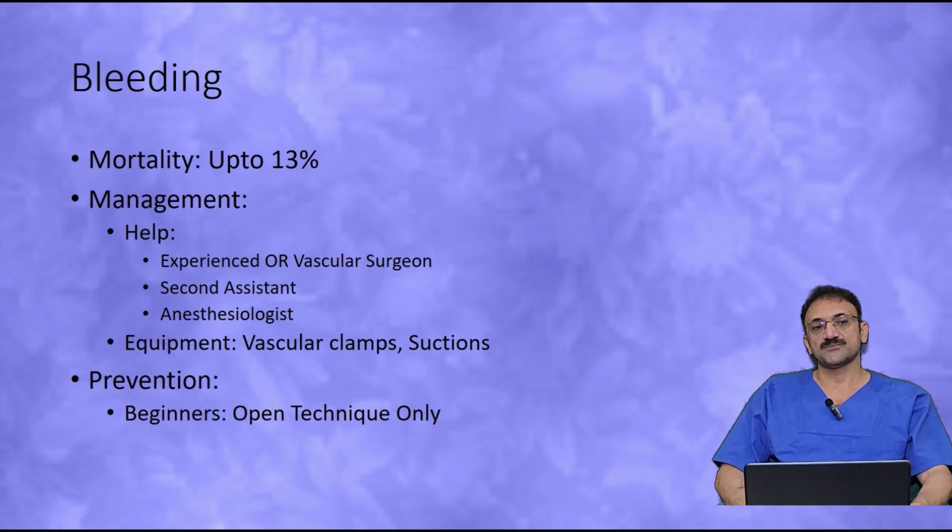This first trocar can be a 5 millimeter. For example, in a right-sided nephrectomy, you place it in the right iliac fossa and create pneumoperitoneum. The port is 5 millimeters, so you bring in a 5 millimeter telescope. The vision will not be good, but at least it will be better than a blind procedure.